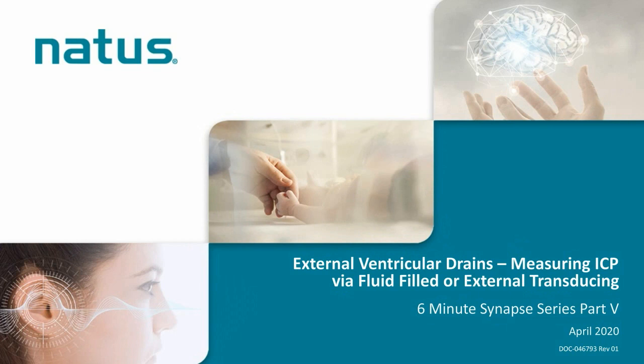In this session, external ventricular drains, measuring ICP via fluid-filled or external transducing, we will explore external ventricular drain concepts including hydrostatic pressure, how to properly level the drain, and common troubleshooting.